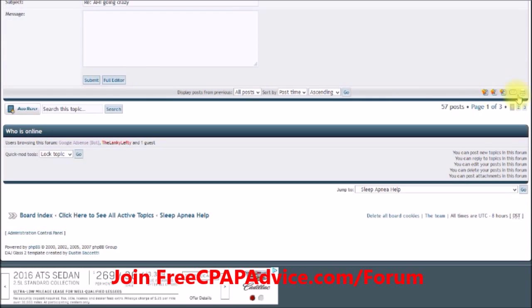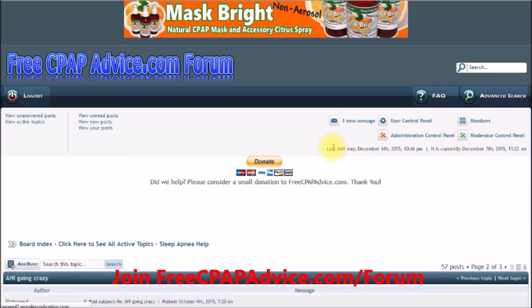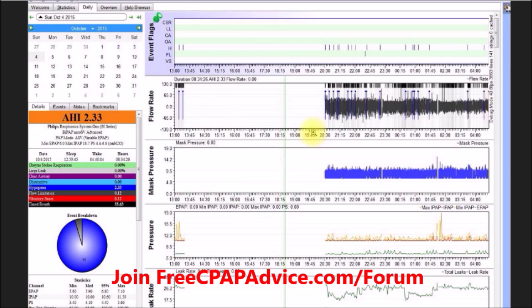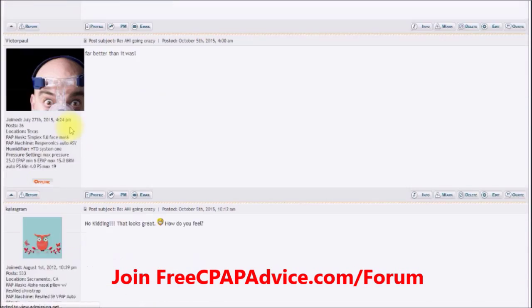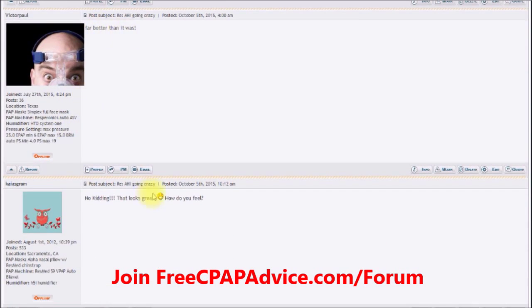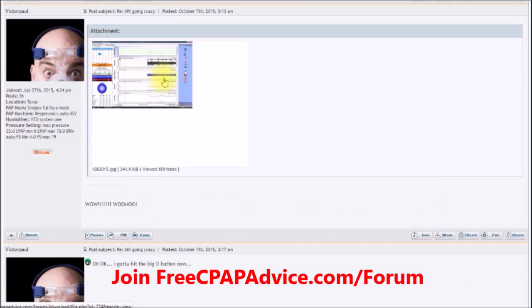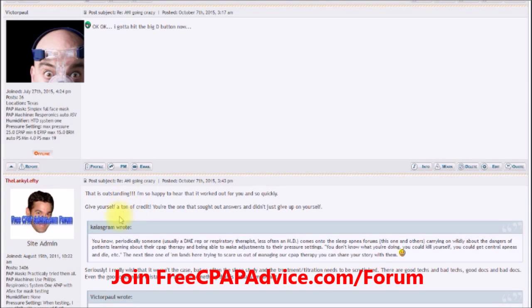I asked about his pressure settings and pointed out the problem. He changed the settings, and here's the first night after — the improvement is much better. The AHI dropped from 65 down to 2.3, just with the appropriate settings. Some hypopneas are still tagged but overall much better — and he confirmed it looked great.